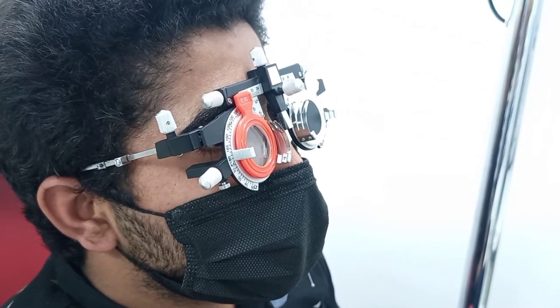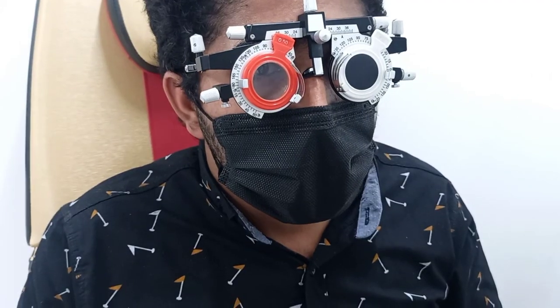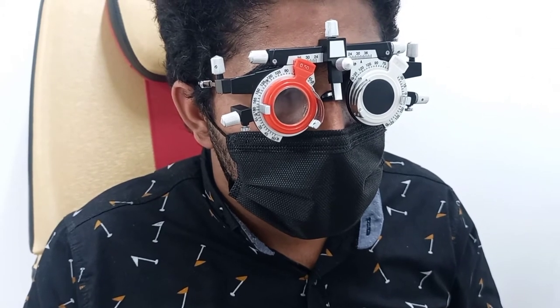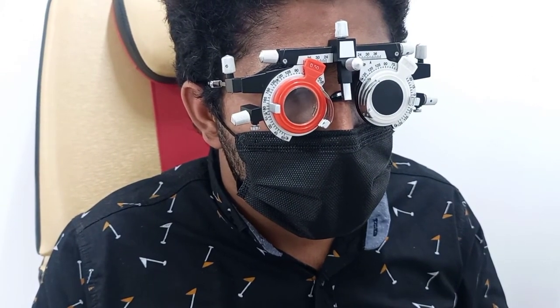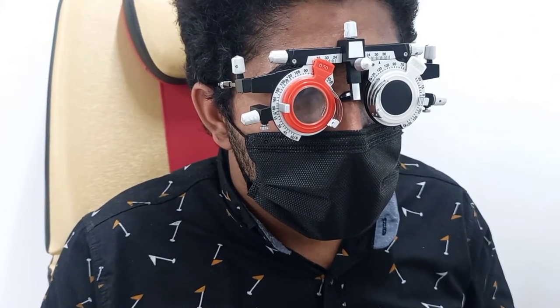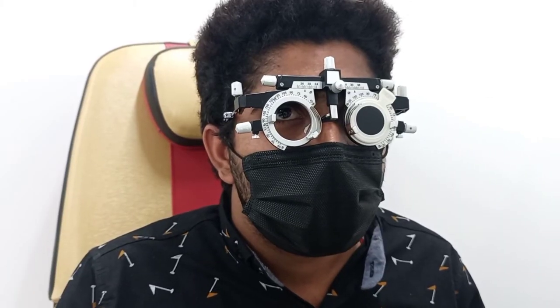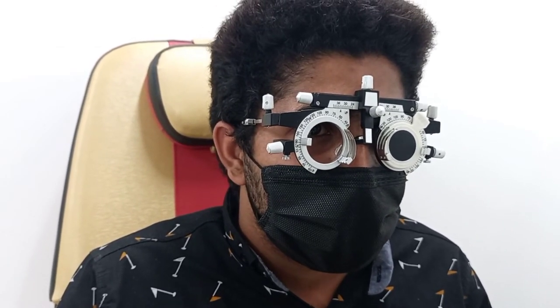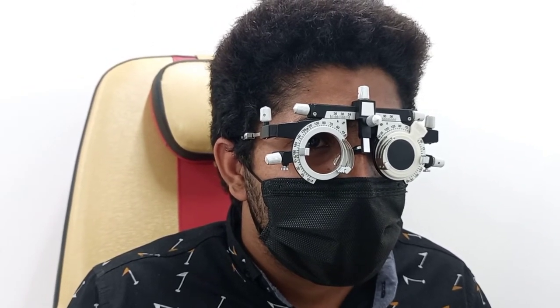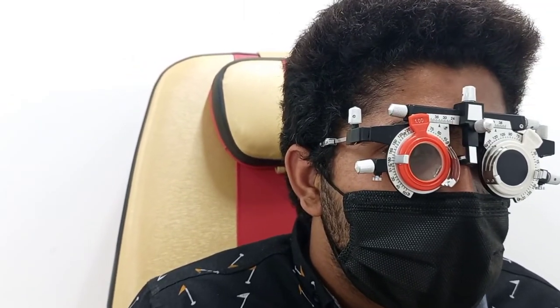So our patient is myopic. Since the patient has preferred the minus spherical lenses, we will now increase the minus power until the patient achieves maximum visual acuity. I will increase the minus power before the patient's eye.